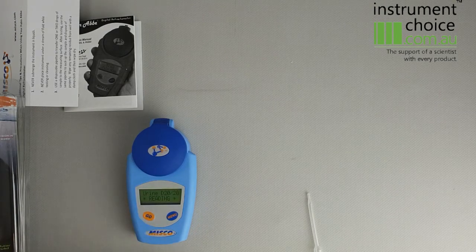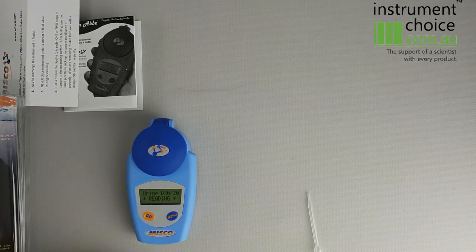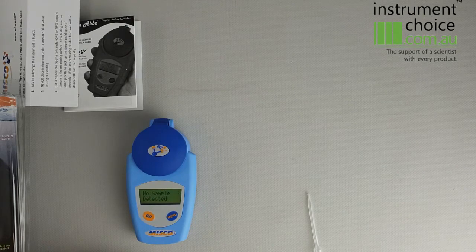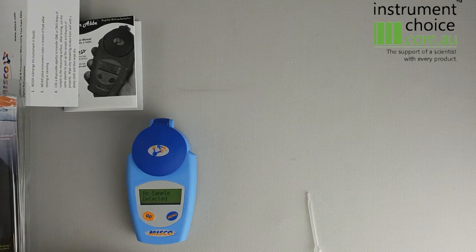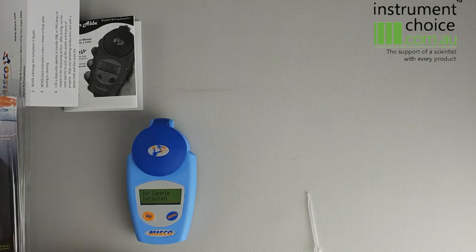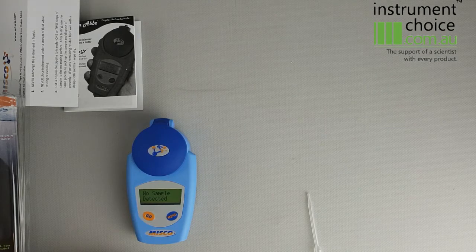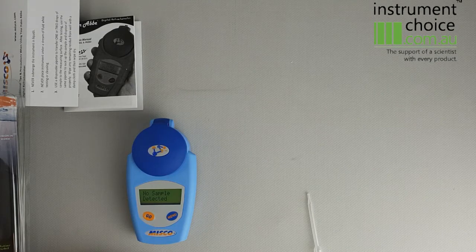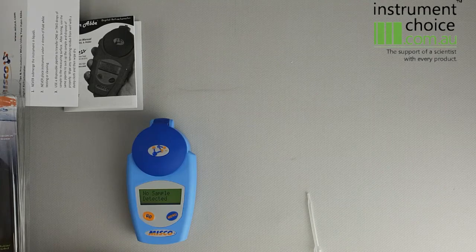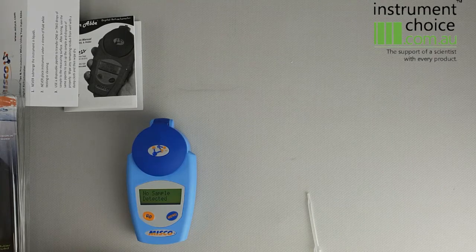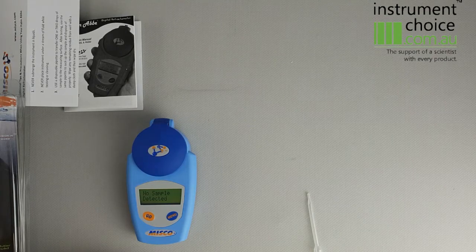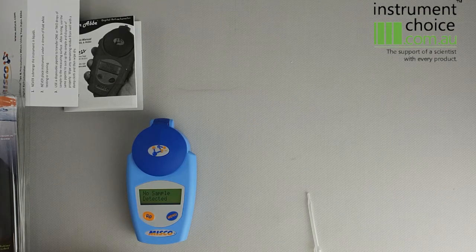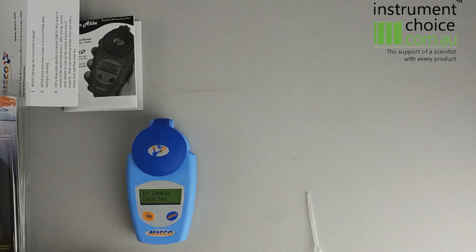Obviously when I push GO now, there's no urine on there, so it'll just give you a no sample detected. If there is a urine sample on there, it'll give you a reading in specific gravity content, and then you can establish the risk of dehydration whether it be athletes, workers, or anyone else that you need to do dehydration testing on.